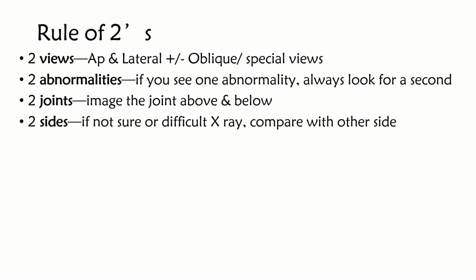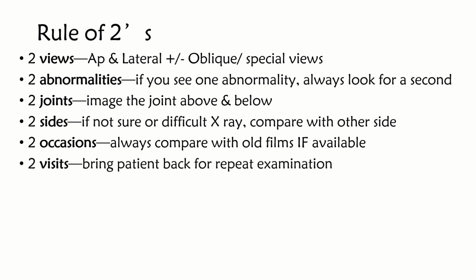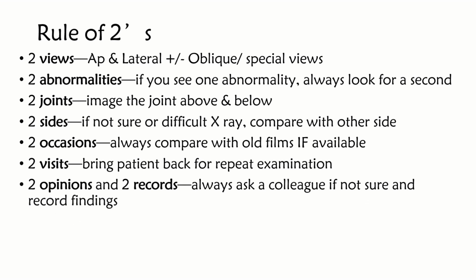Then two sides. Sometimes when there is a diagnostic dilemma, especially in pediatric elbow fractures, one could get an X-ray of the opposite side to compare the two X-rays. Then two occasions. Always compare the current X-ray with the old X-rays of the patient if they are available. Then two visits. The patient is asked to come in for follow up after some time so as to repeat the X-rays.